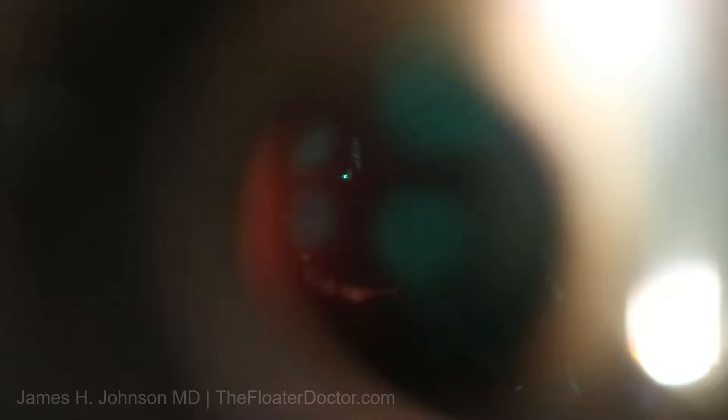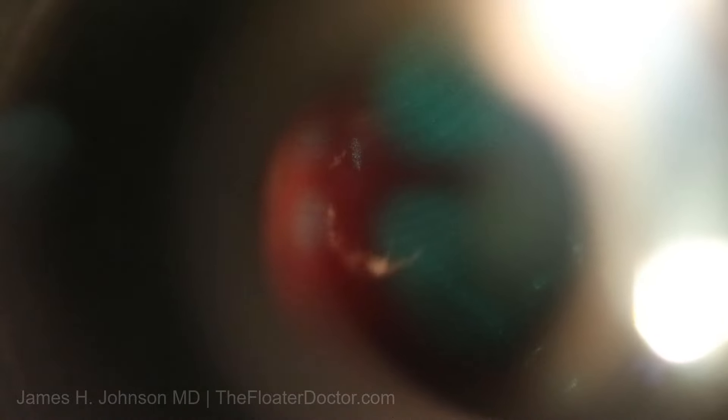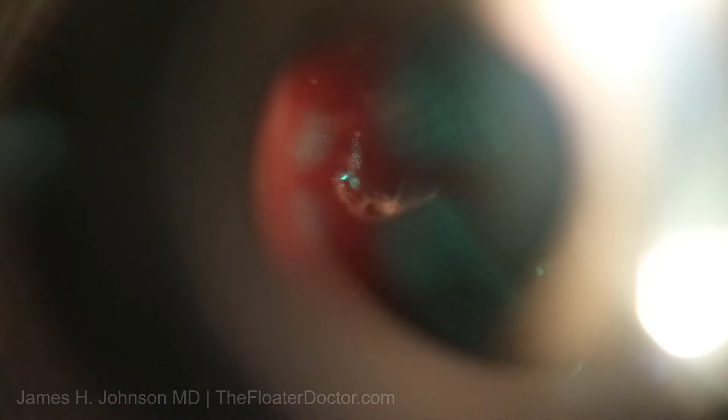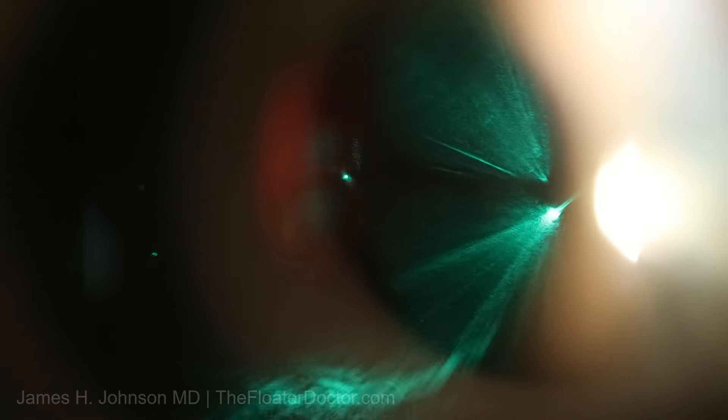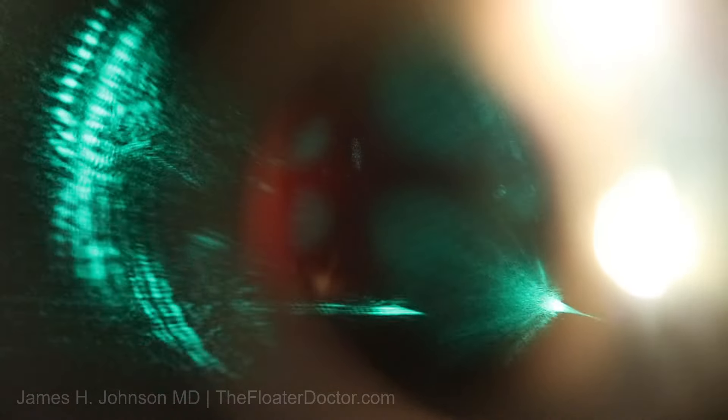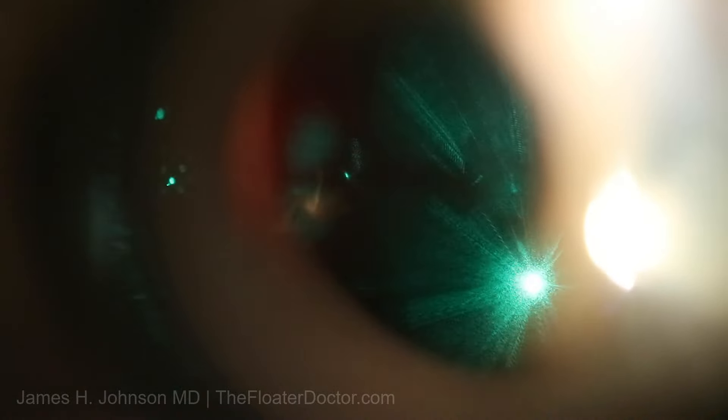At some point we'll do a little flick of the eye and bring things forward, so little pieces will break off. Kind of like in the Tour de France when you get the breakaways — you have to have a few guys go and bring them back into the peloton. These are my favorite to treat. I don't get these very often. I wish I did, because when I'm having a conversation with a patient I do like to sound more confident.